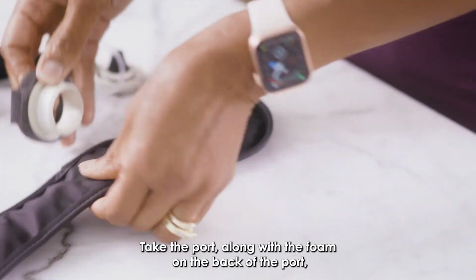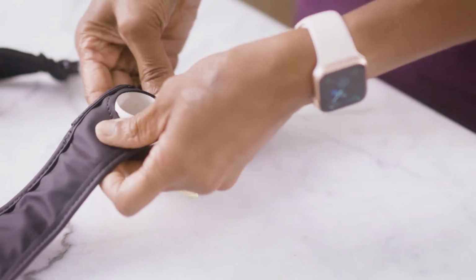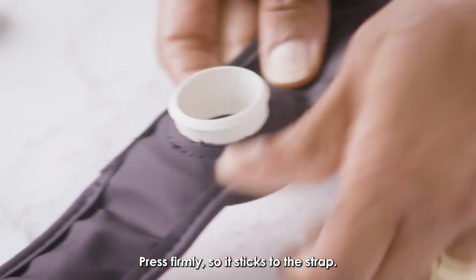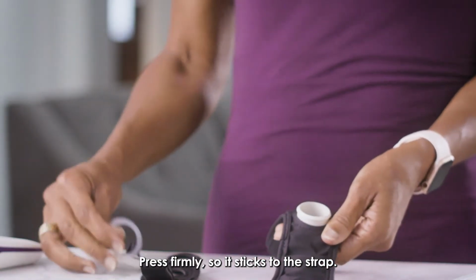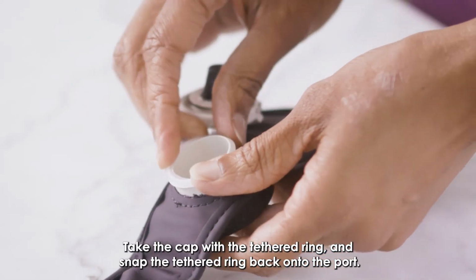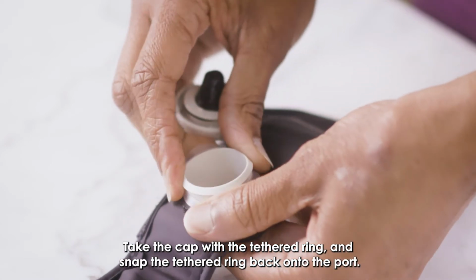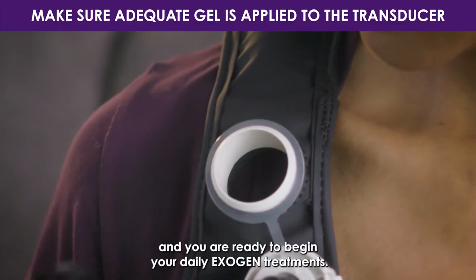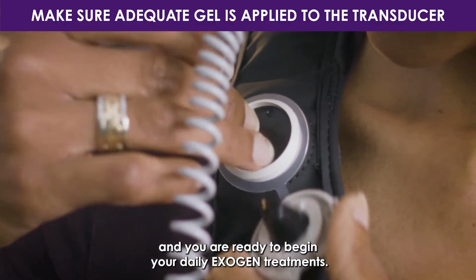Take the port, along with the foam on the back of the port, and push it through the hole from the back side of the weighted applicator strap. Press firmly so it sticks to the strap. Take the cap with the tethered ring and snap the tethered ring back onto the port. Your weighted applicator strap is now assembled, and you are ready to begin your daily EXOGEN treatments.